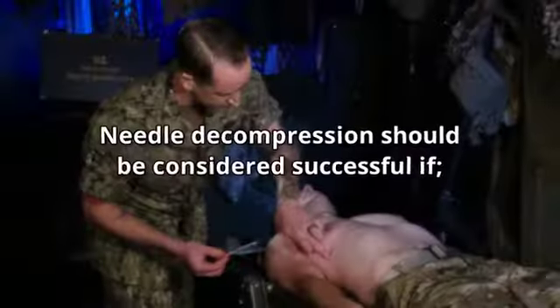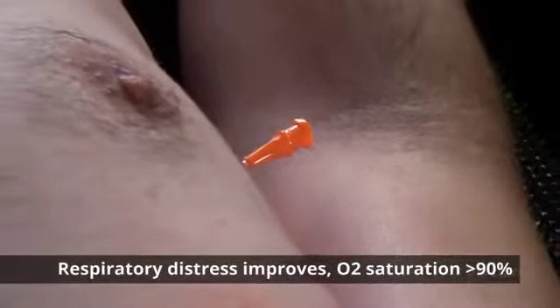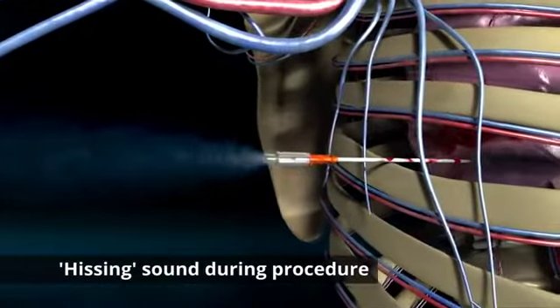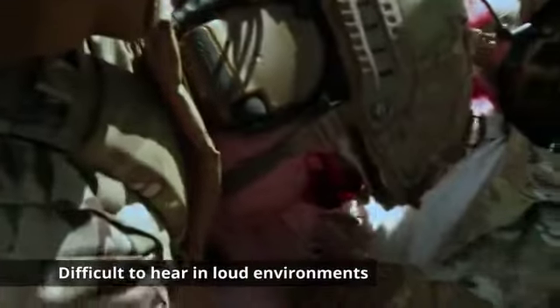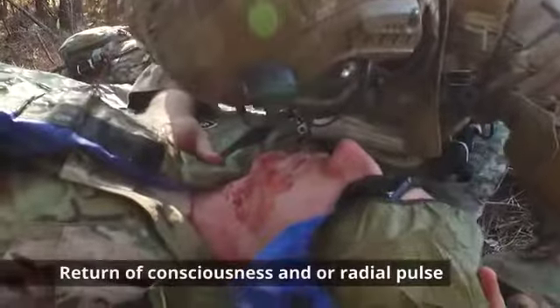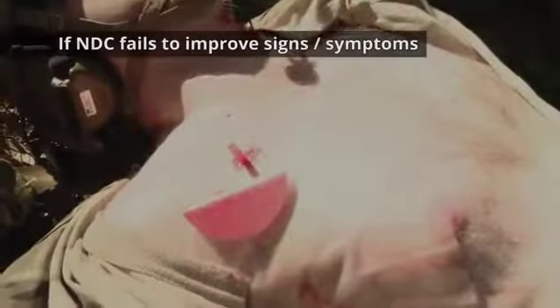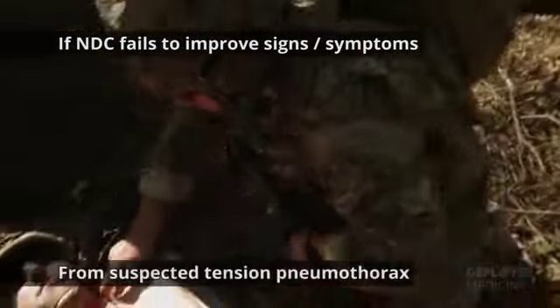The NDC should be considered successful if respiratory distress improves or there is an obvious hissing sound as air escapes from the chest when NDC is performed. This may be difficult to appreciate in high noise environments. Success may also be indicated if a casualty with no vital signs has returned to consciousness and/or radial pulse.